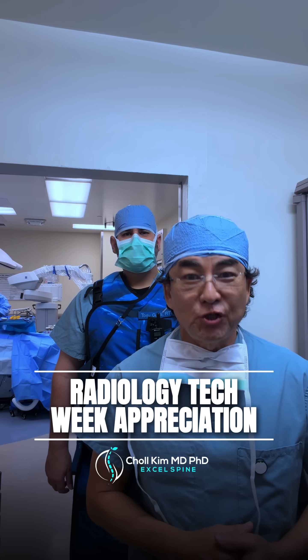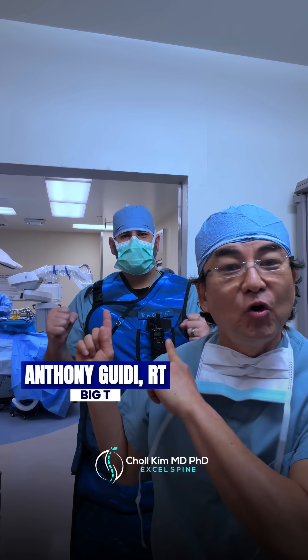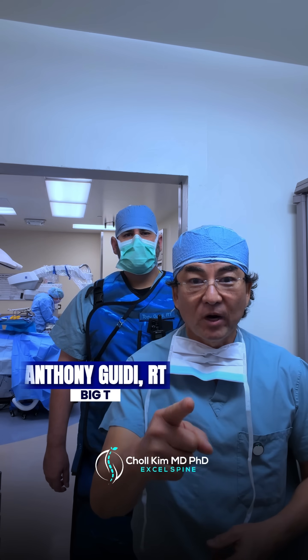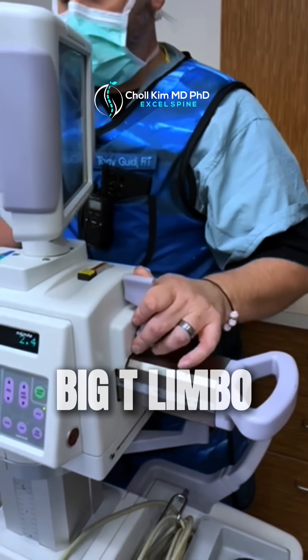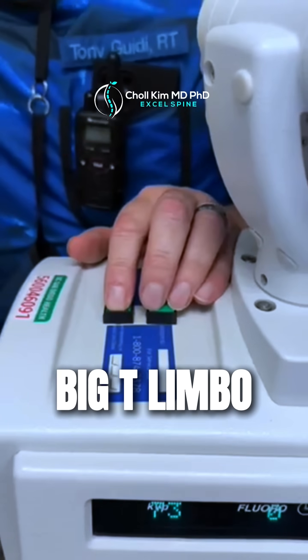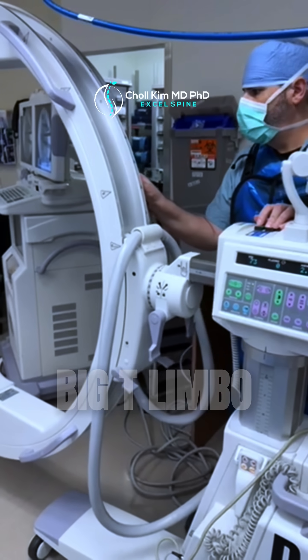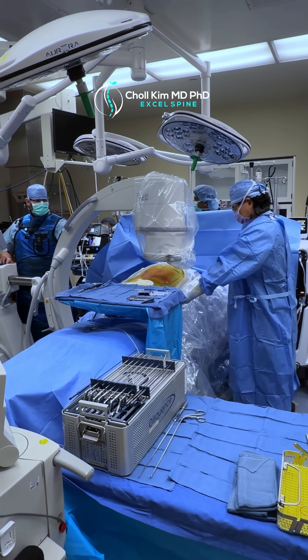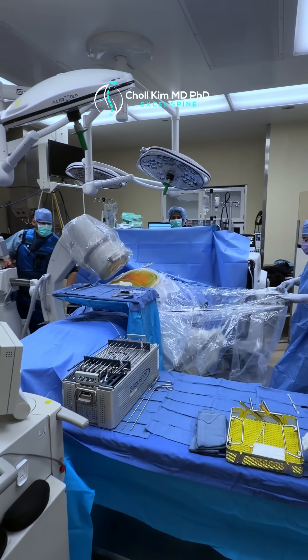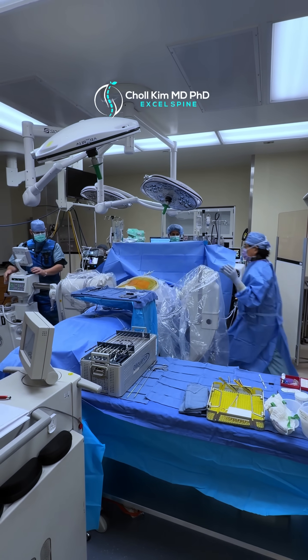It is radiology tech appreciation week and I have Big T Tony here, who is my radiology tech extraordinaire and my wingman. We want to show you two things. One: the Big T Limbo — that's when the C-arm comes in, gets an AP, and then needs to go under the table to get a lateral image, changing positions 90 degrees. We want to show you how you go in really smooth, like a professional limbo artist — elegant, not bumping into things, not looking totally lame by doing one thing at a time.